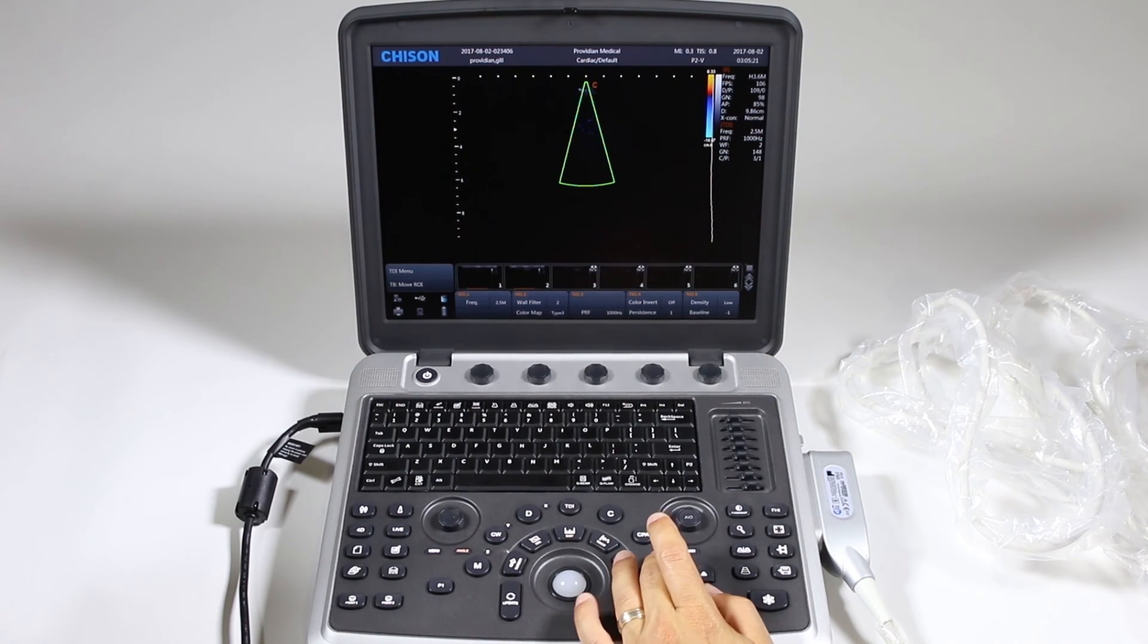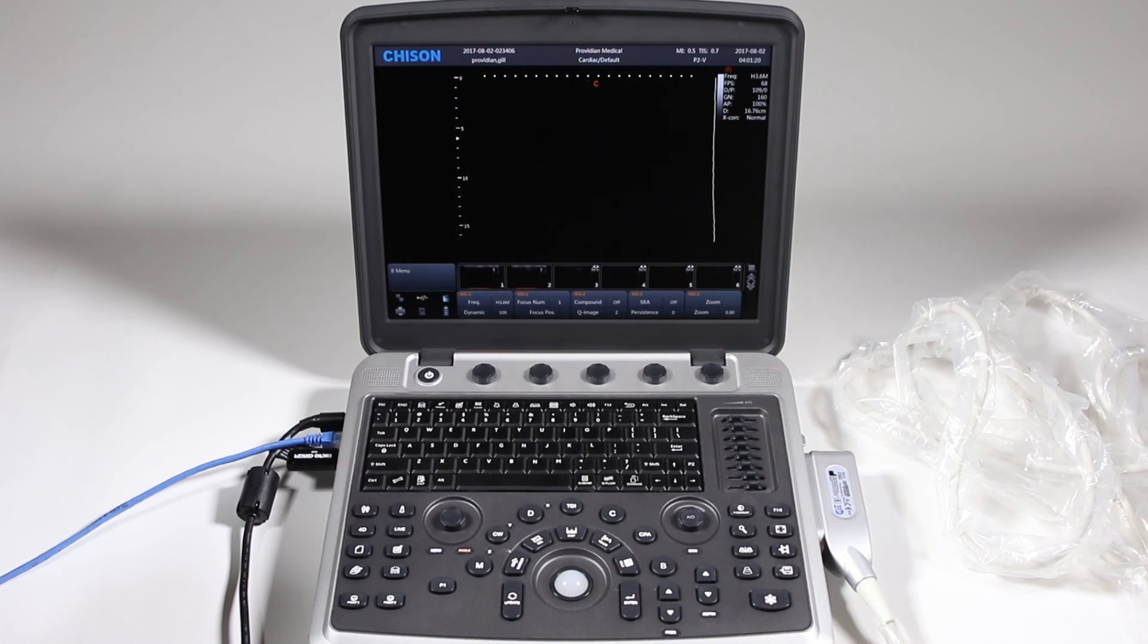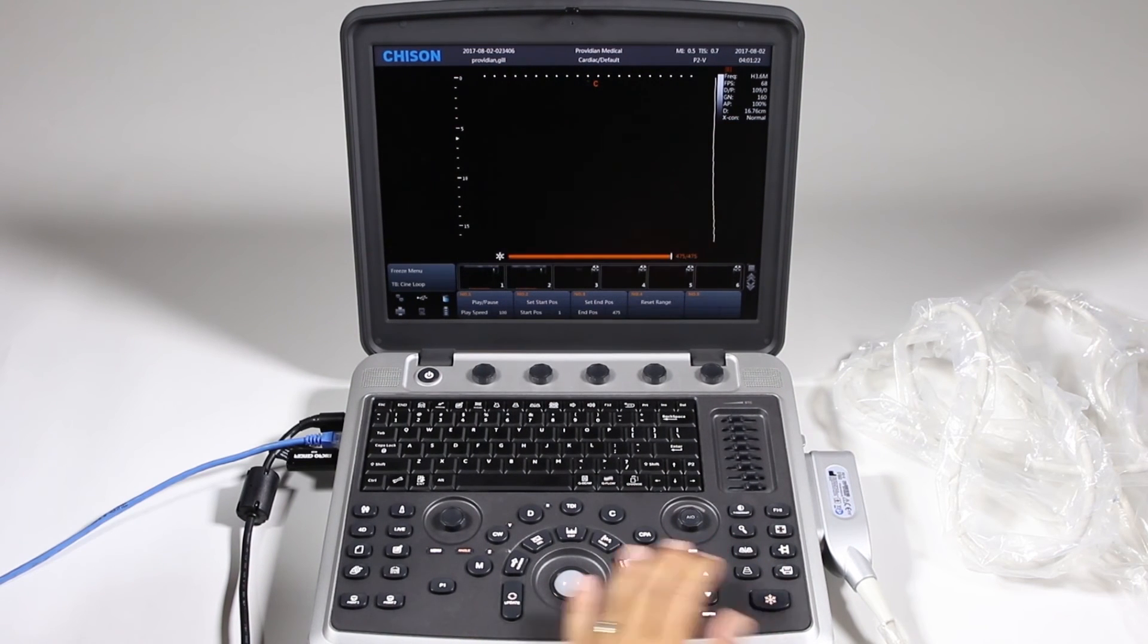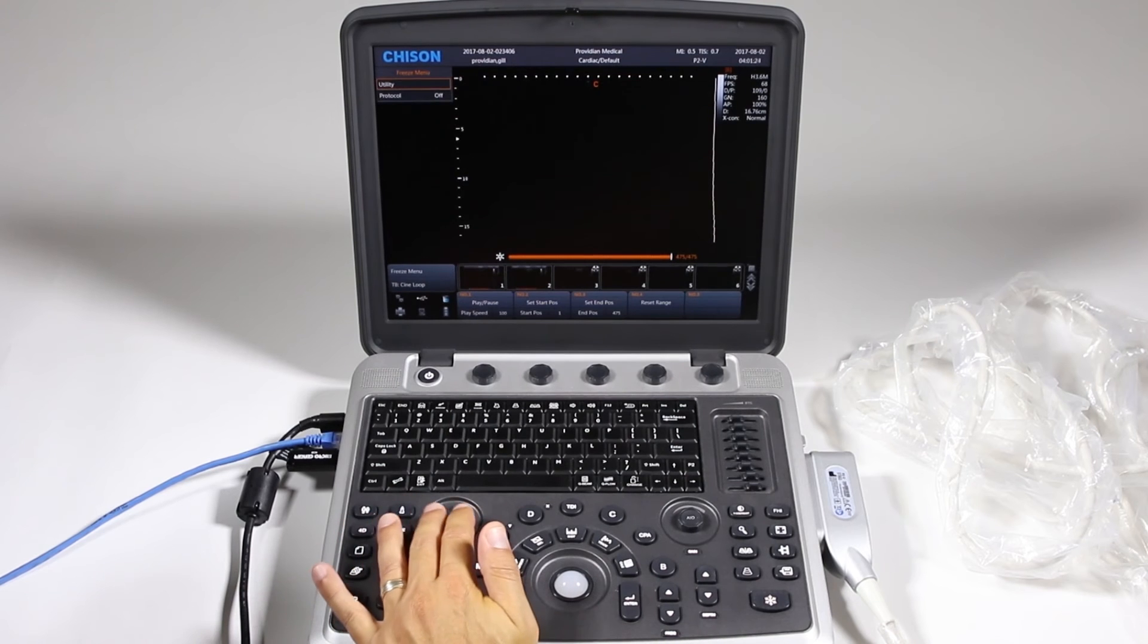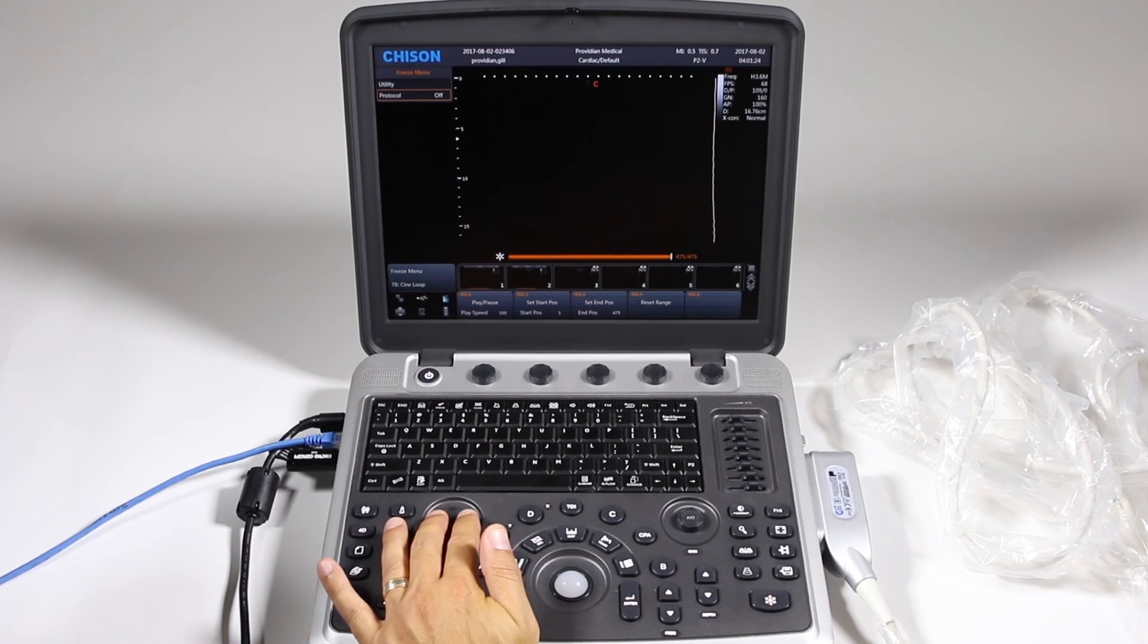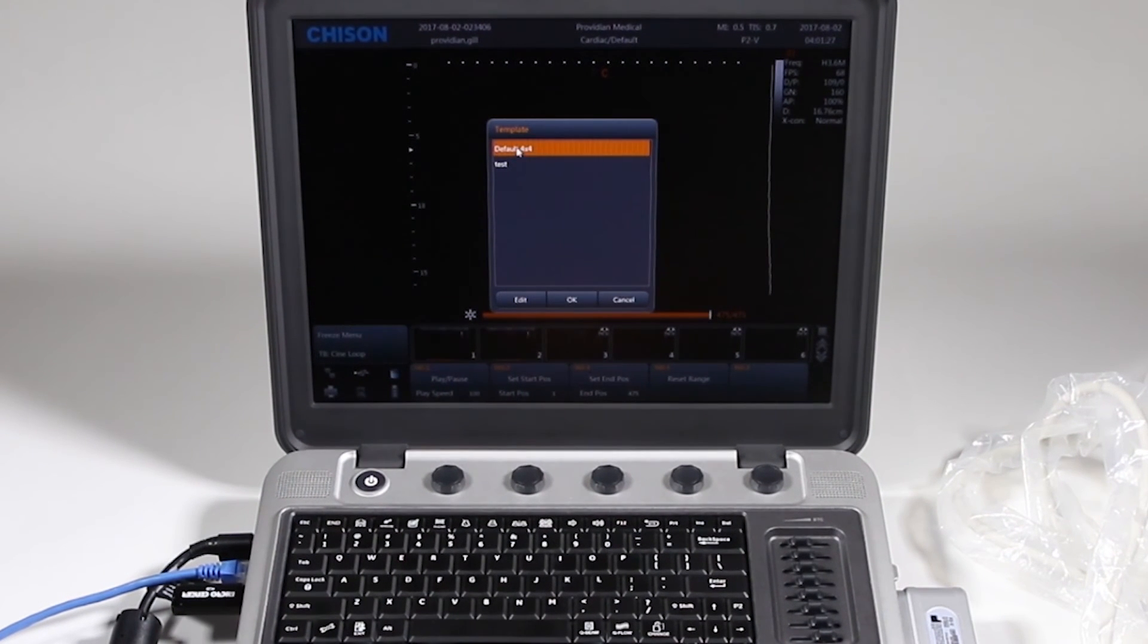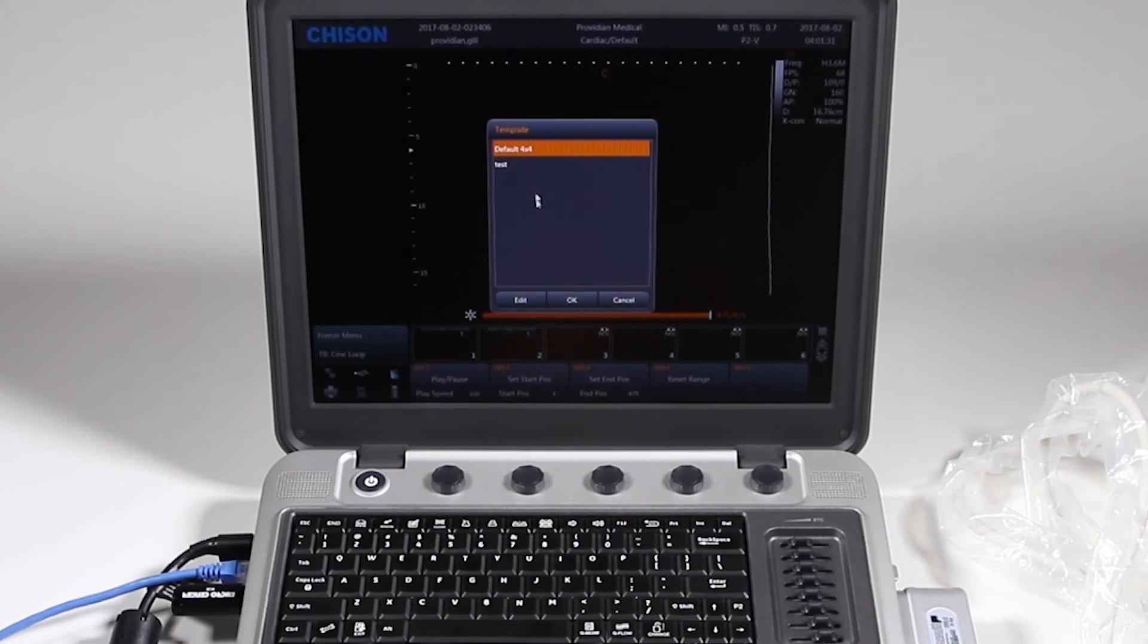Go ahead and hit B mode to get out of that. Now to activate stress echo, first you need to freeze the image and press the menu button down and you'll see protocol. Go ahead and click that and you have your default and I created a custom one named test there.